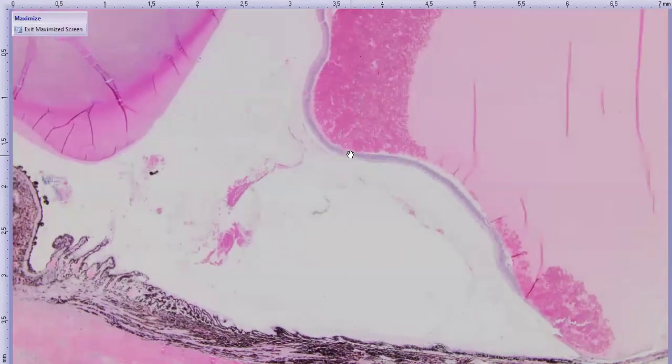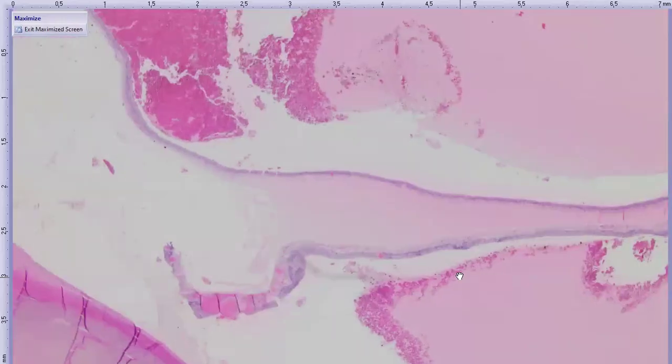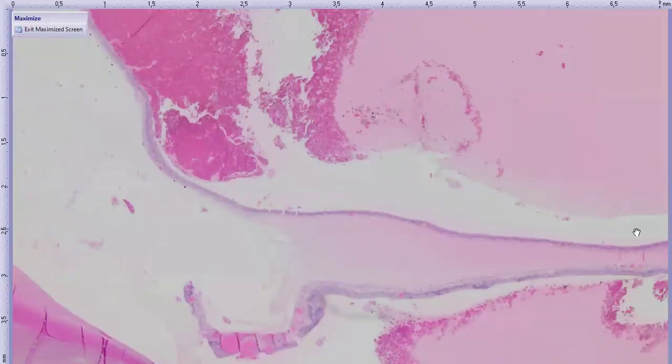Lenses within normal limits. And then as we move into our posterior segment, there is indeed retinal detachment. Here's a segment of our retina. There's a good amount of hemorrhage in the subretinal space, as well as the vitreous, and then a large amount of this eosinophilic or very proteinaceous material, kind of fan over here. So here's more of our detached retina.